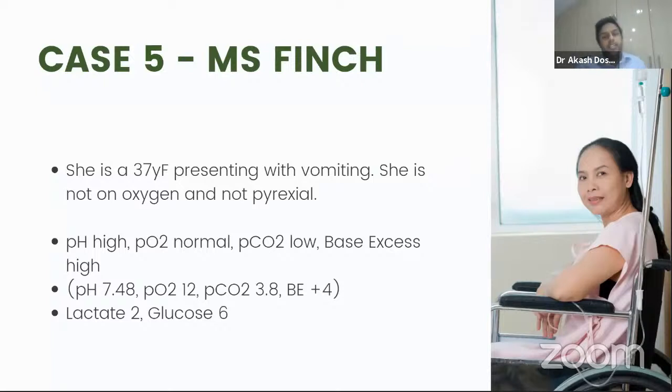And next we have Miss Finch. Miss Finch is a 37-year-old female presenting with vomiting. She is not on oxygen and she's not pyrexial. So C, we've got the clinical context. H, for oxygen: she's not on oxygen. Her PO2 is normal at 12. I'm happy.